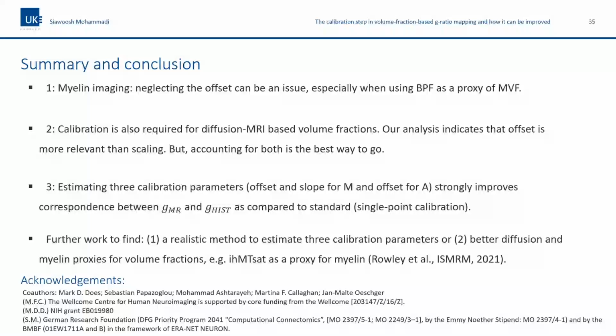Well, maybe this is kind of general, but I think for histological validation, ex vivo neuroimaging can be potentially very important. But just wondering, because ex vivo imaging has its own limitation, like maybe relaxation time, diffusion parameter itself depends upon maybe postmortem preparation time or whatever, something non-biological. Then maybe how to go beyond this type of issue that may potentially impact your G ratio estimations.